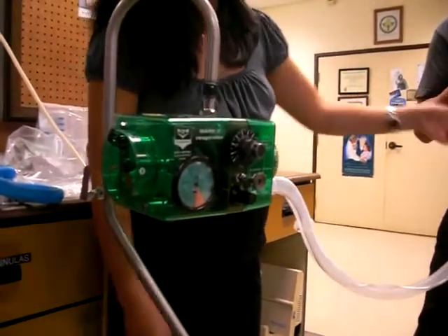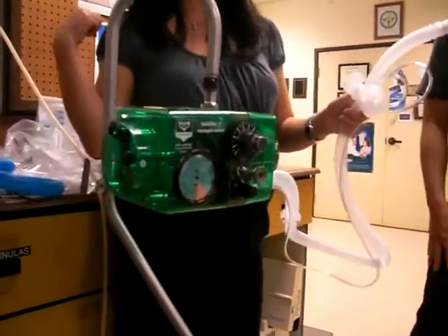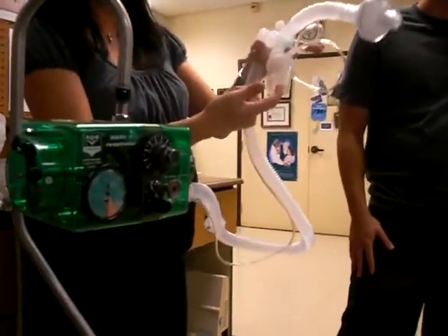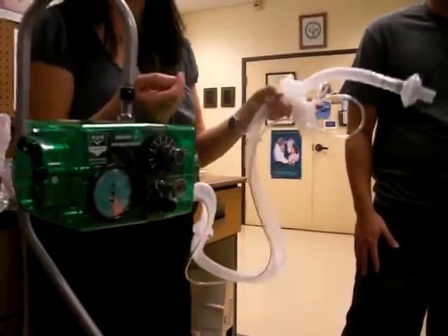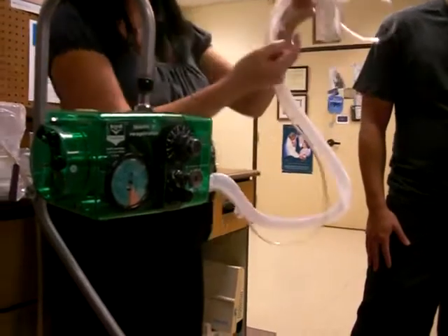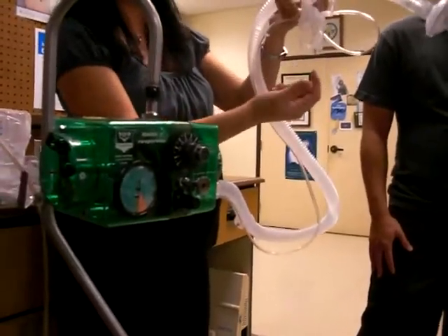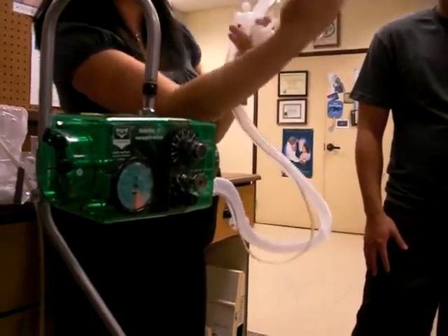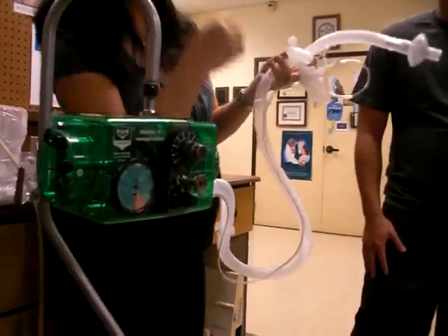Okay. No mist from the neb, obviously. Is it hooked up? If not, is there adequate solution in here? Because remember, there's dead volume. We talked about dead volume. Whatever is left in there that does not get nebulized. So you might see something in there, but it doesn't get nebulized and nothing is coming off already. You know, it's probably done.